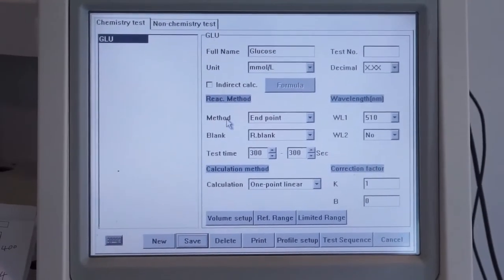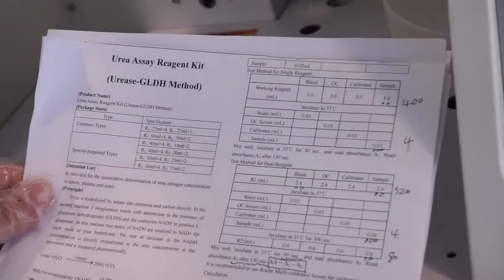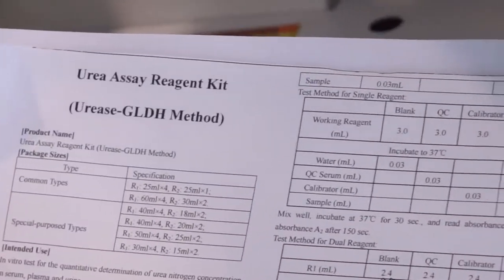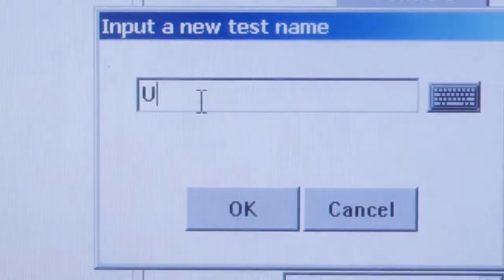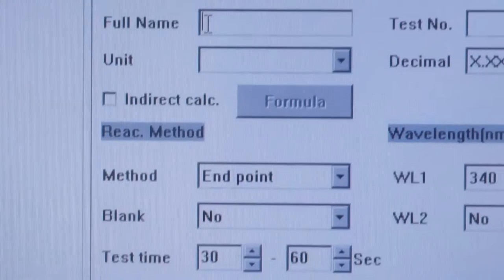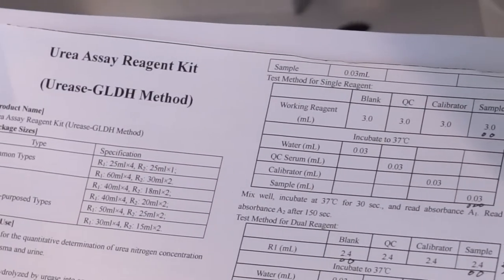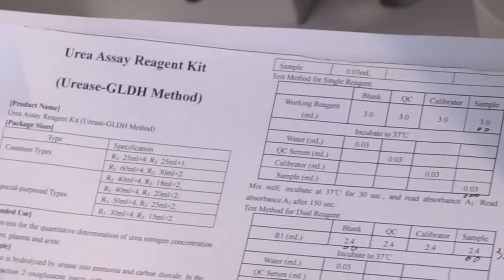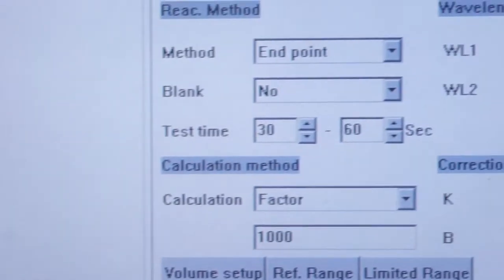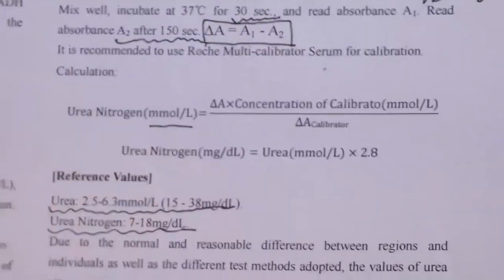Okay, and next, we input the UIA parameter. The method is singular, you can see. Input new, input UIA. And the item name, you can input UIA. And also the unit, you can check the formula here, the unit.